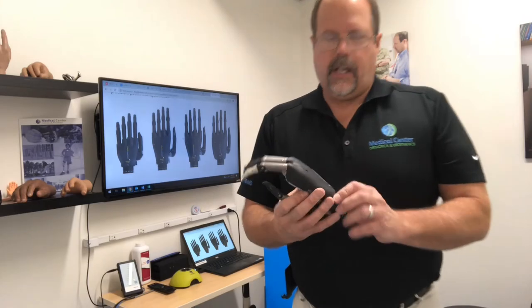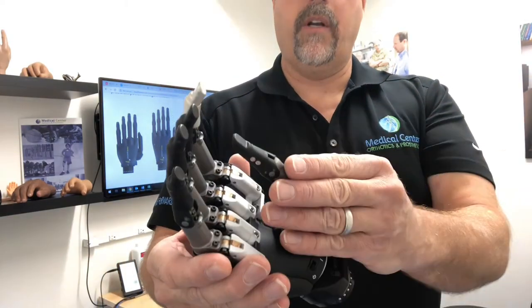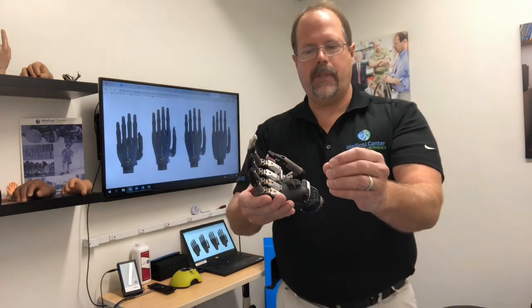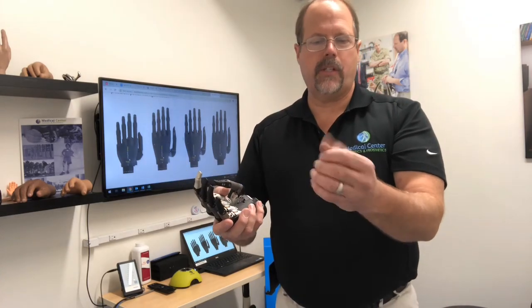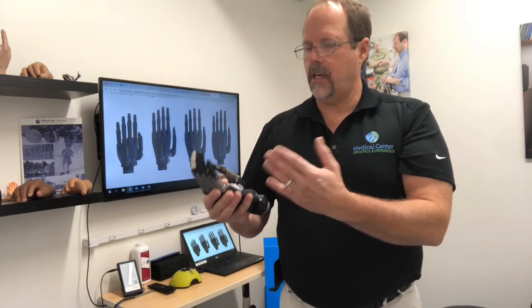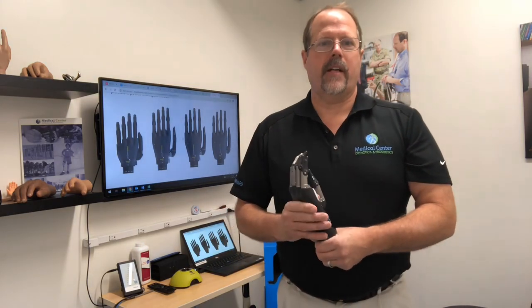This is the Touch Bionics iLimb Quantum Titanium. You can see the titanium reinforced fingers — it's a very nice device. It's one of only two or three hands on the market that can have the thumb powered into abduction in an opposition position. Two of the most common grasps people use in activities are opposition and lateral key pinch, and this hand does both of them, as well as 24 other grips. You can even program two custom grasps into it. It's a nice device — if you want to learn more, look us up at Medical Center Orthotics and Prosthetics. Thank you very much.